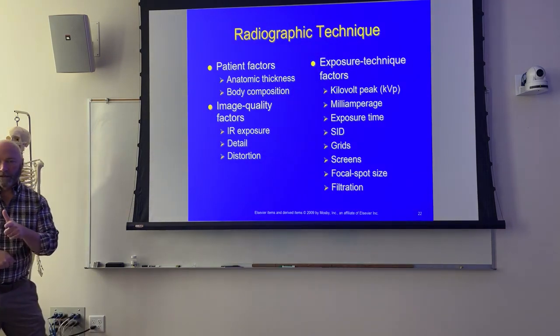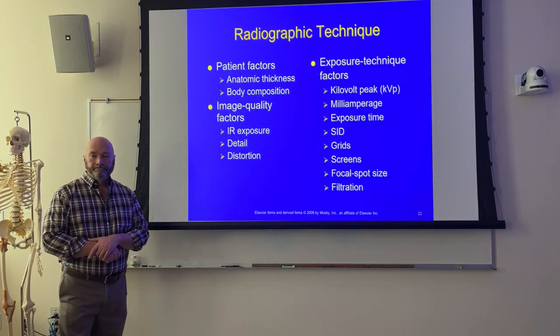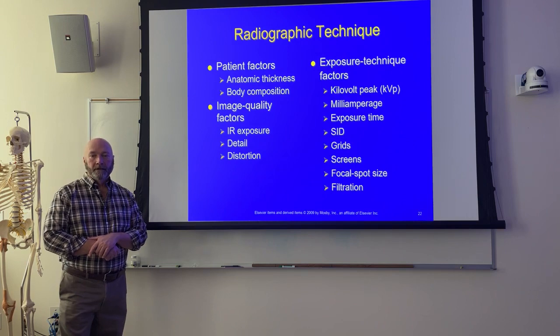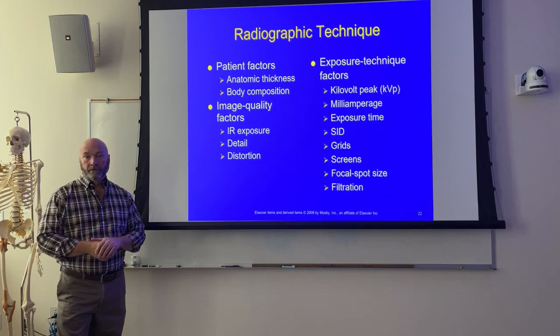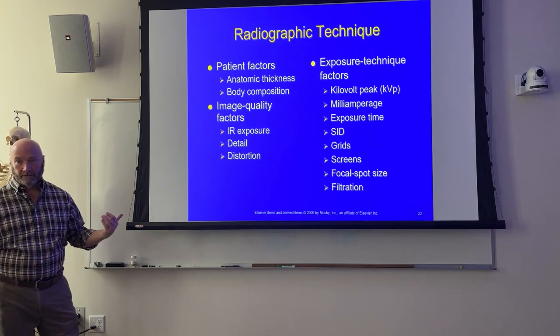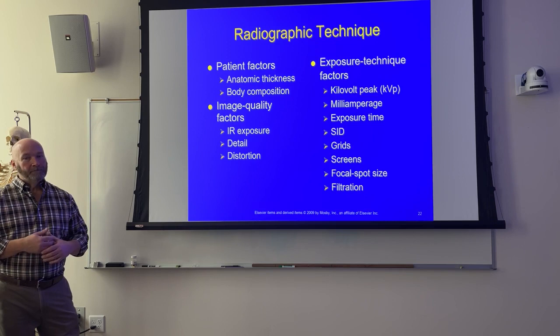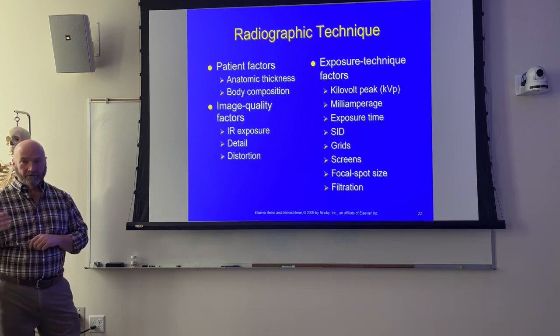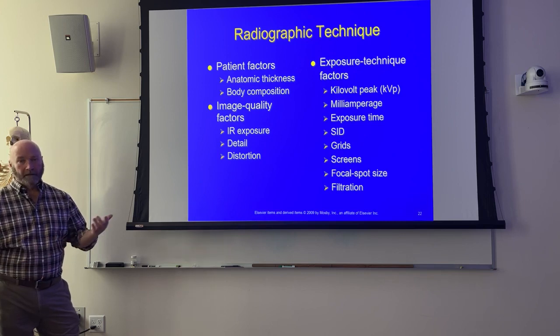On focal spot, whenever you're saying kVp is kVp, mAs is mAs, and you're changing the focal spot, you were saying that it remains the same. Technique-wise or image-wise? Both. The only thing it should change is sharpness of recorded detail, and that's all. So index number should remain the same. The appearance of the image should be identical. The exposure to the patient should be identical, as long as your machine allows you to make that exposure on either the large or the small focal spot. Yep, that makes sense.